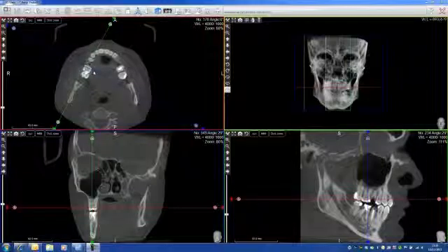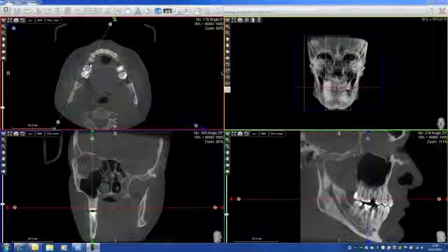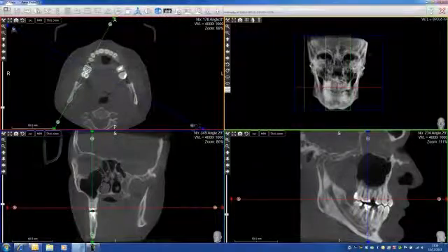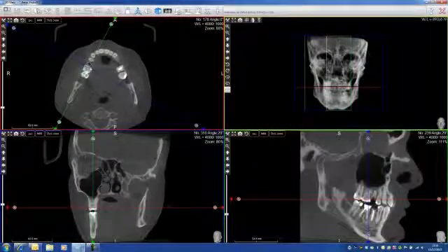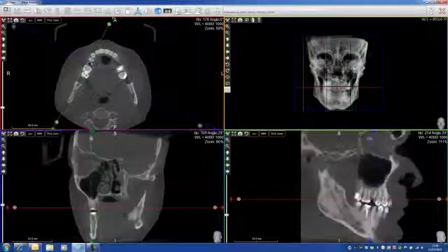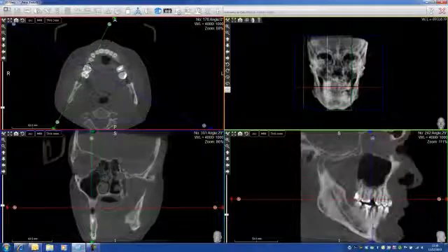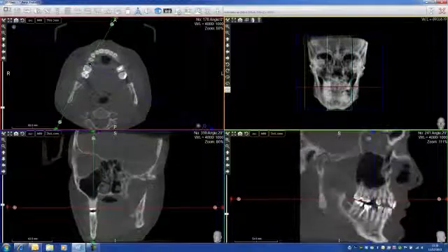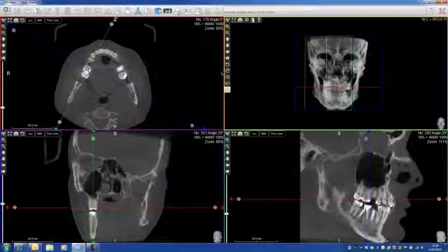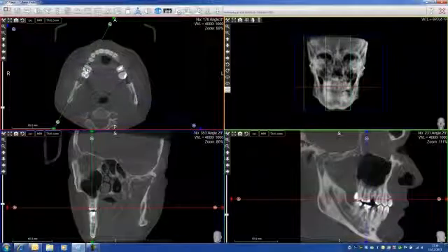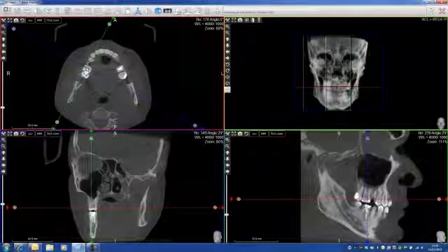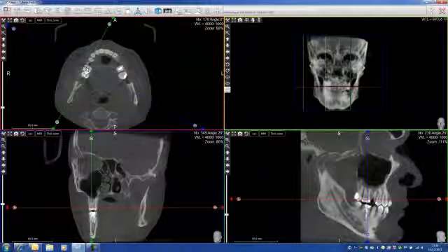Now, the fun part of the software. We are going to trace the mandibular canal. For this, we just need to position ourselves on the actual view, on a pre-molar or molar, and play with the cursor until the mandibular canal is showing up.